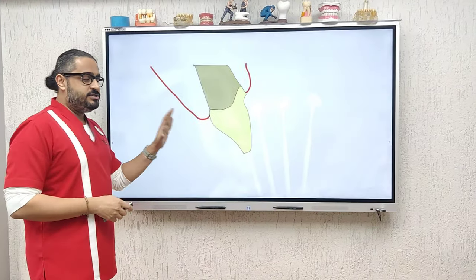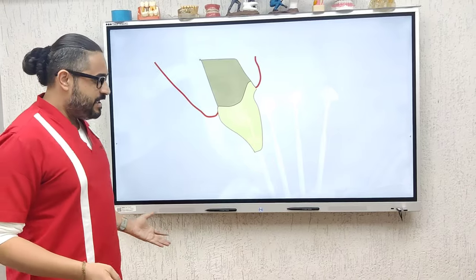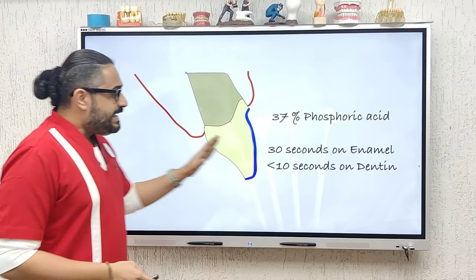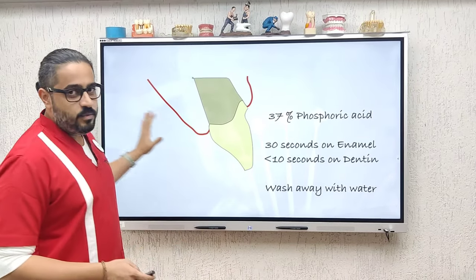Now move your attention to preparing the tooth for bonding. We've all been doing this for years — nothing different. You have your total etch technique: 37% phosphoric acid on the entire prepared tooth surface. Enamel gets 30 seconds of contact. If any dentin is exposed, remember less than 10 seconds. Go ahead and thoroughly wash this away.